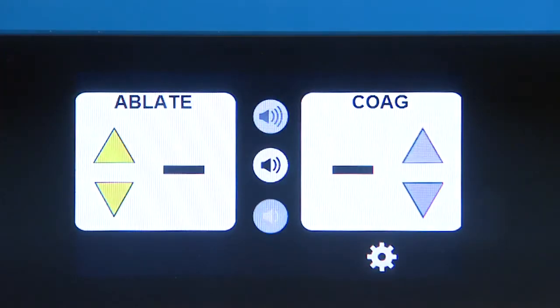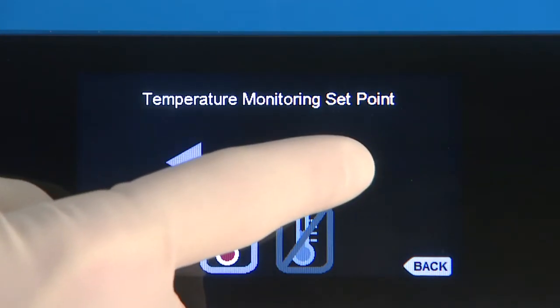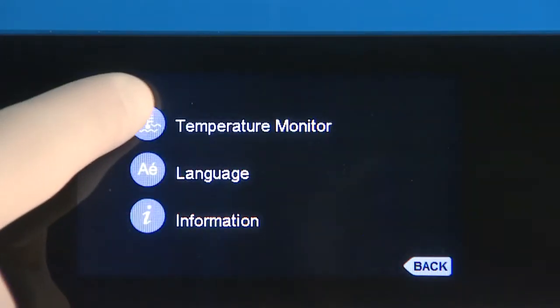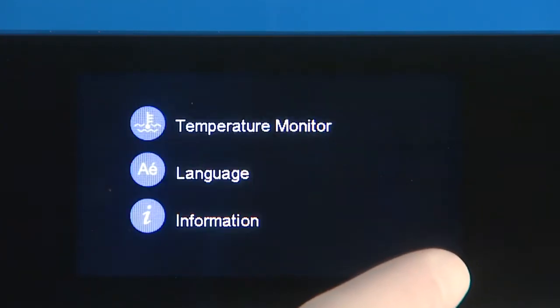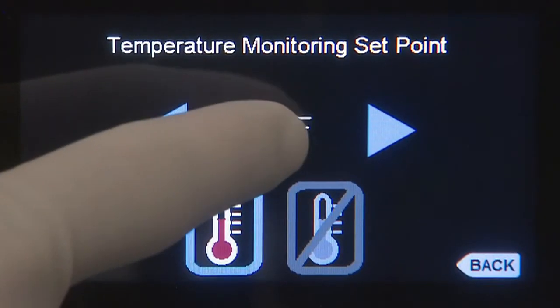To change the default temperature of 43 degrees Celsius, select temperature on the options menu. Adjust the temperature using the arrows on either side, then press the back button to save the selections. To toggle the temperature monitoring feature on or off, simply tap the icon located below the numeric display. To change the display from Celsius to Fahrenheit, tap on the numeric temperature display.